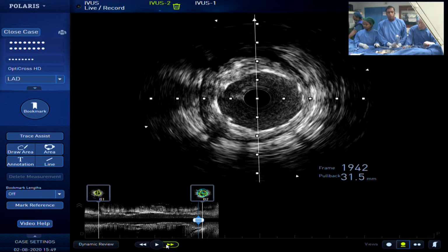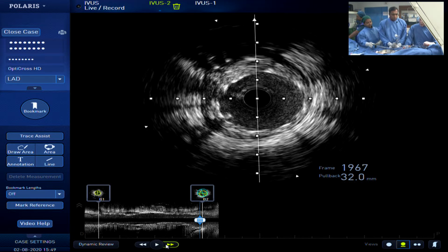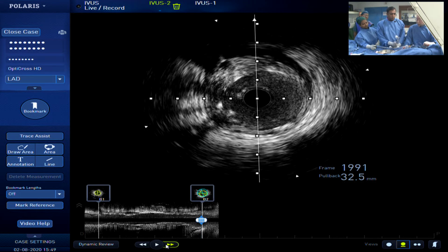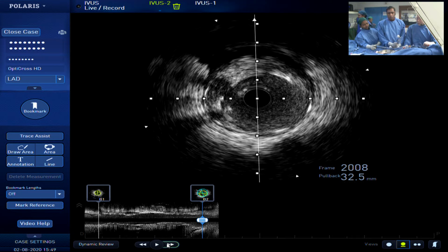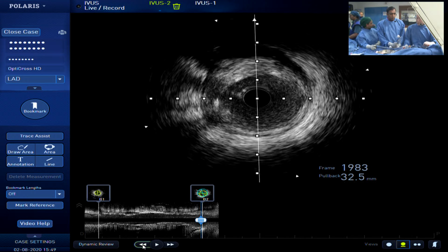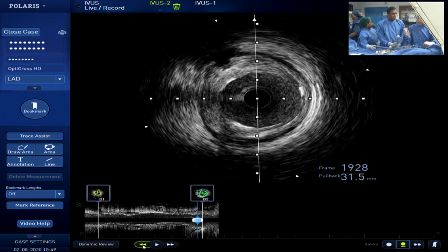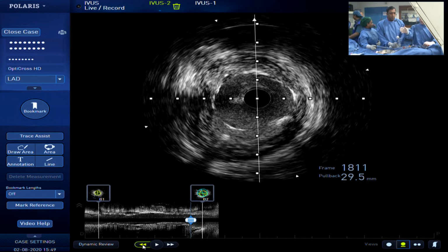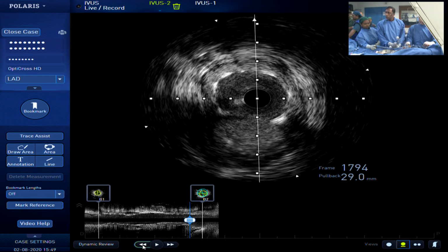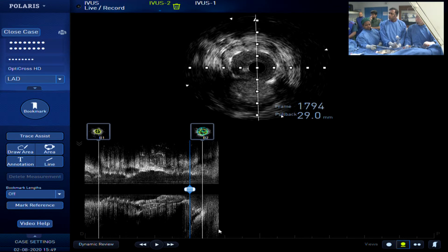And the question is, in this kind of situation, the pinch is caused by the carina shift. So it is a matter of the decision whether we have to cross the proximal or distal part. I think if you have stent boost, that can also be applied here. With stent boost, you can see exactly the stent and balloon wire crossing also.